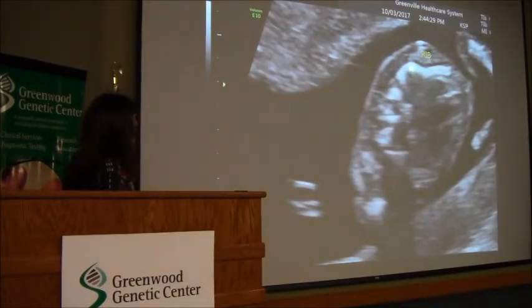All right, towards the end here. This is a rib with an unusual configuration. Oh, wow. Osteogenesis imperfecta. So we can see shortened long bones. We can see fractures of long bones or ribs. We can see demineralization.